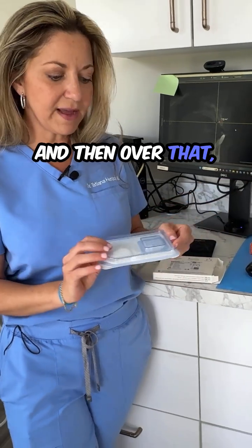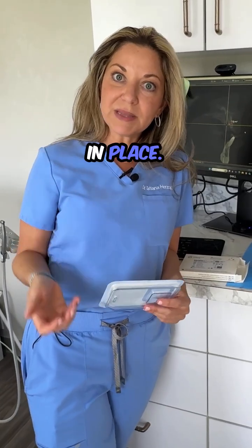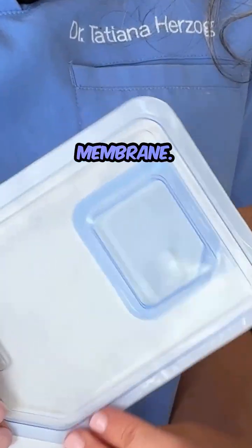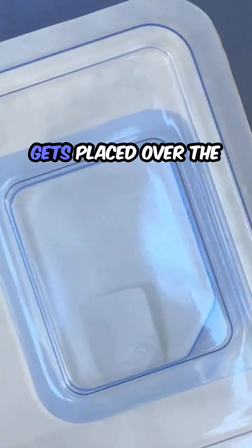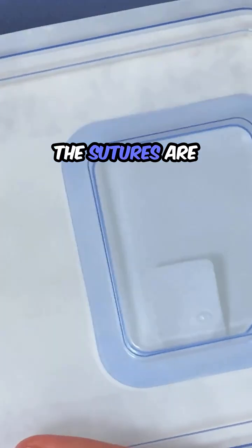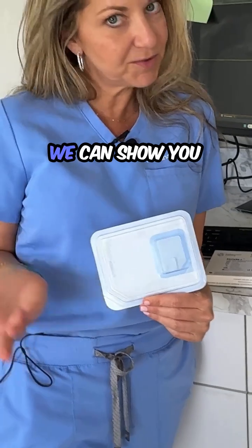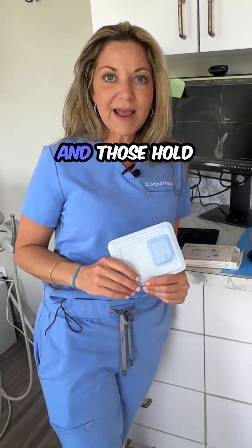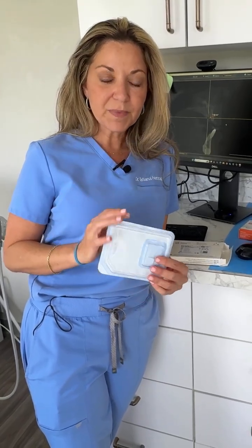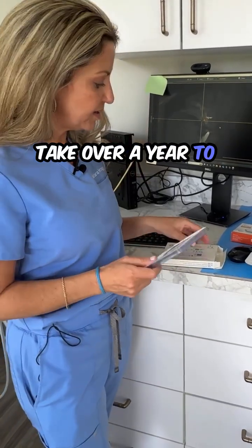We make a sticky bone from that, that becomes like a putty. And then over that, we have to use something to cover the bone because we want to keep the bone in place. This is a membrane — it is a collagen membrane, made out of collagen. It gets placed over the bone but underneath your skin. The sutures are tacked into place, or sometimes we use things called tenting screws, which we can show you at a later date. And those hold the position of the bone and the membrane. This specific membrane will dissolve on its own and can take over a year to dissolve.